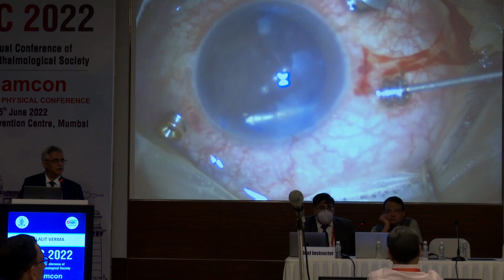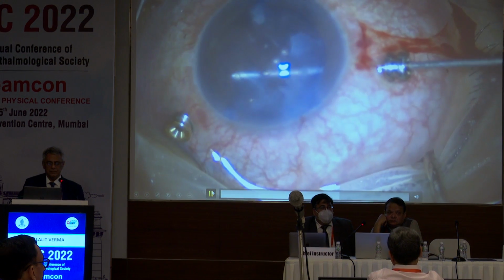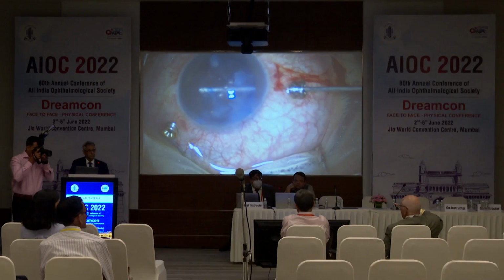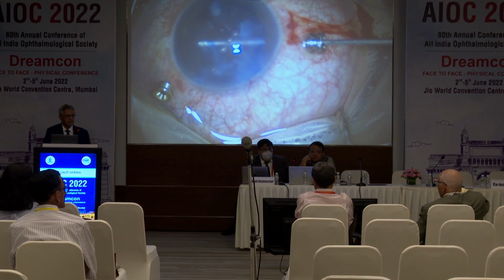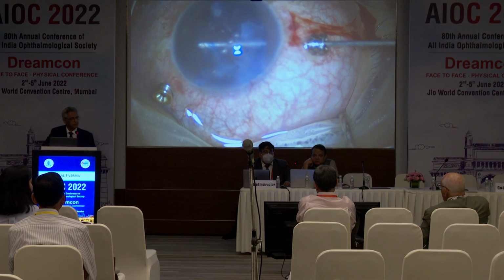Yes, Dr. Gerard. I have one question and one comment. If you're doing it from anteriorly and you put the triamcinolone in, if you leave any in, will it still absorb later on? There's no issue. Triamcinolone can be easily left behind, a few crystals. It will absorb. In fact, sometimes deliberately we do it.